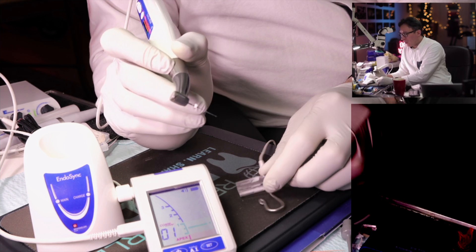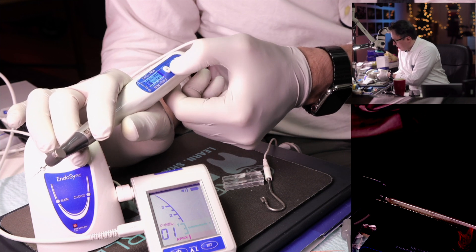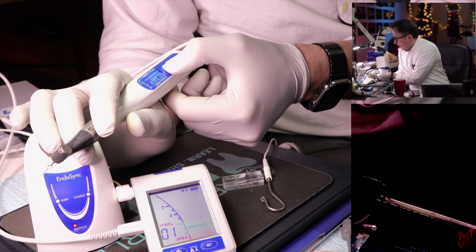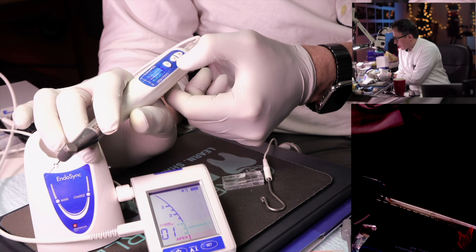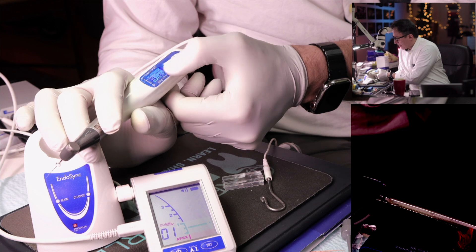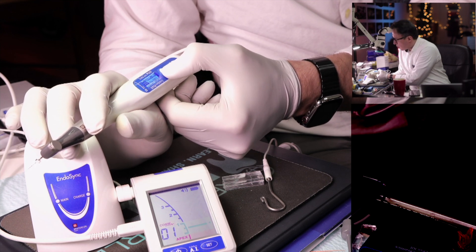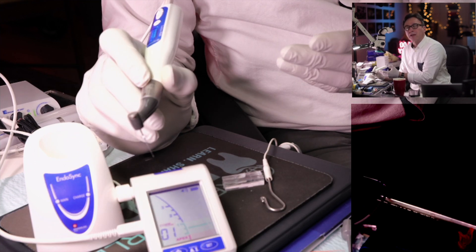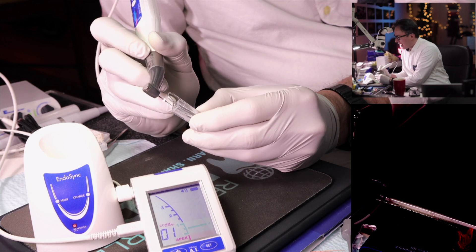To access settings, press and hold the S button, then press again to cycle through: clockwise/counterclockwise, speed, torque value, cutting angle, non-cutting angle, sync on, and apical action. Apical action is set to stop by default. You can change it to apical reverse, or you can toggle sync off entirely — that disables the auto-stop function but still gives you the apex locator reading while the file continues to rotate.